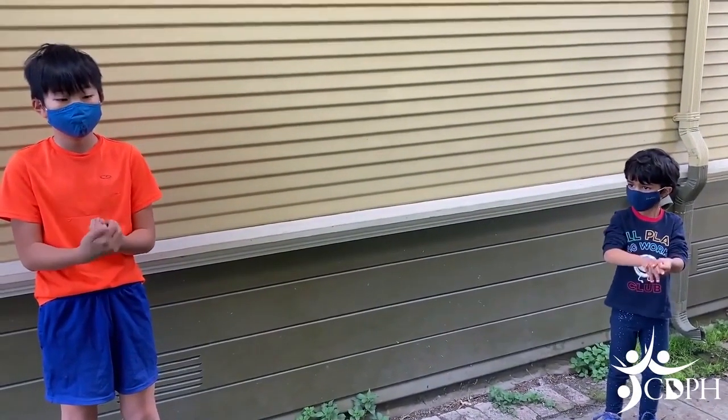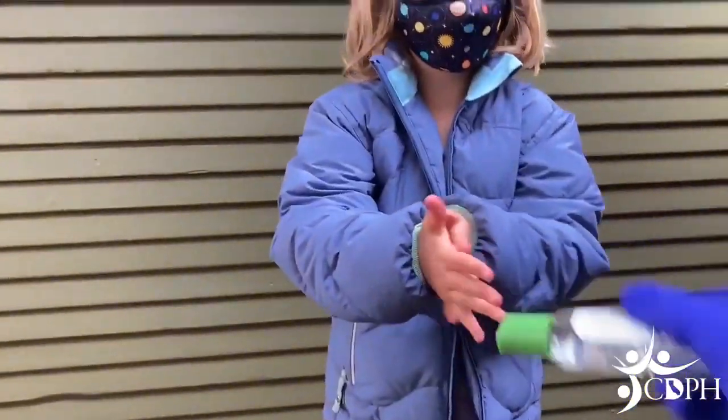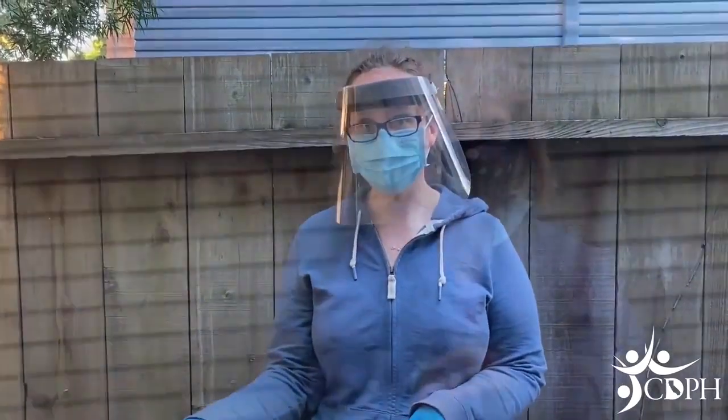Start by standing at least 6 feet apart from the other students. The teacher is going to help you wash your hands before you do the test or give you some hand sanitizer. First, we are going to hand you the swab.